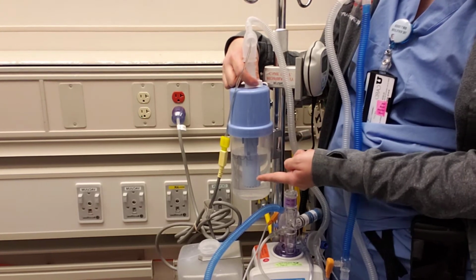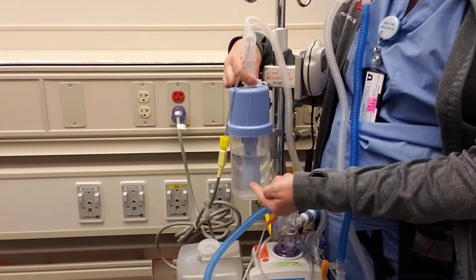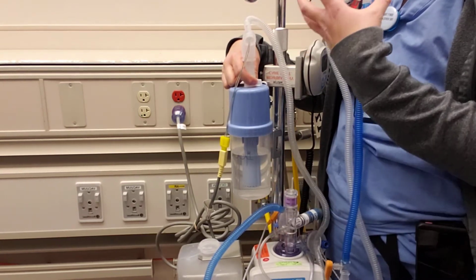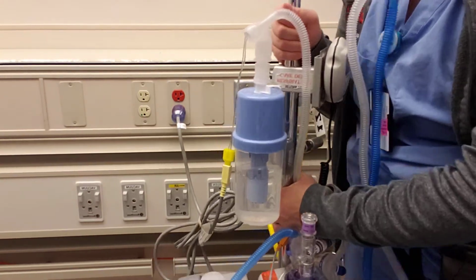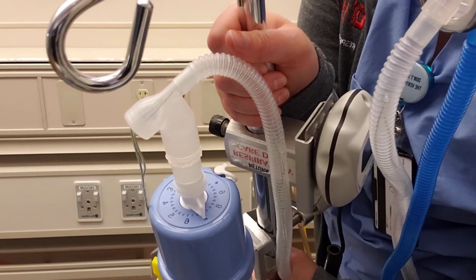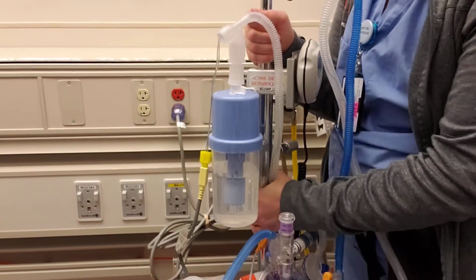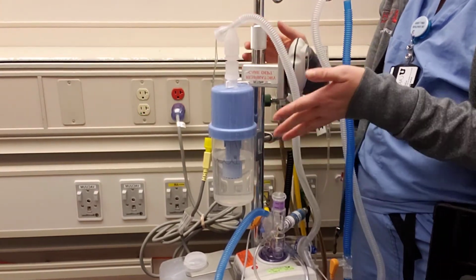That's why we have the line, because we're measuring the actual centimeters of water pressure that we are breathing against to give that CPAP. And you can see how the dial looks up top here, and it just turns to whatever pressure we are delivering.